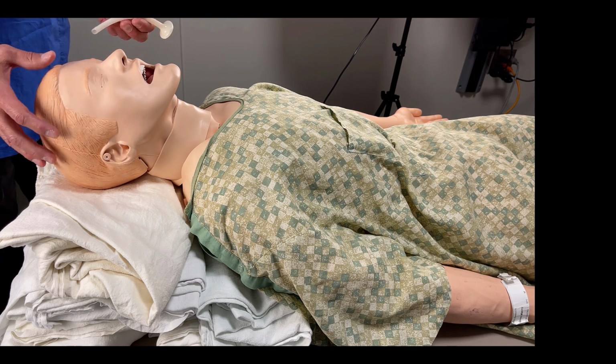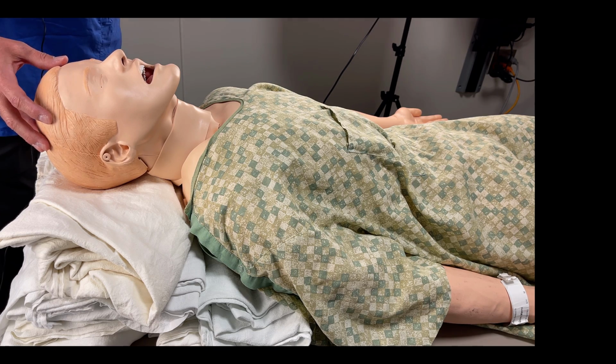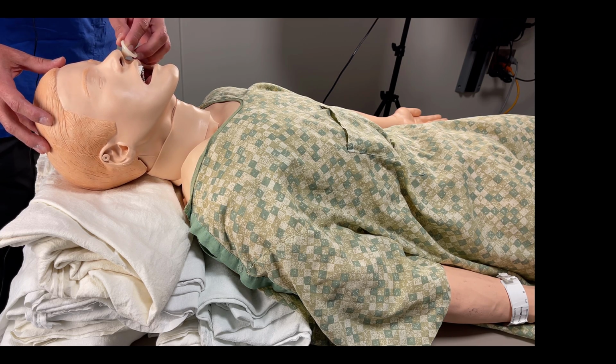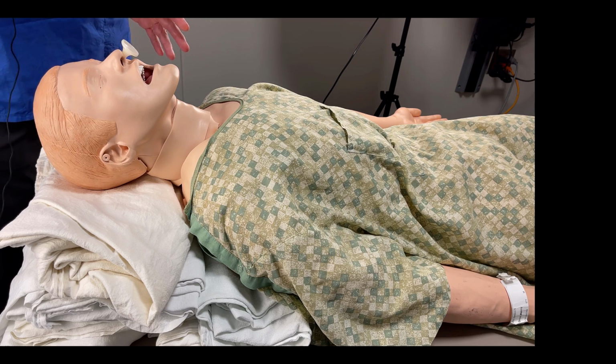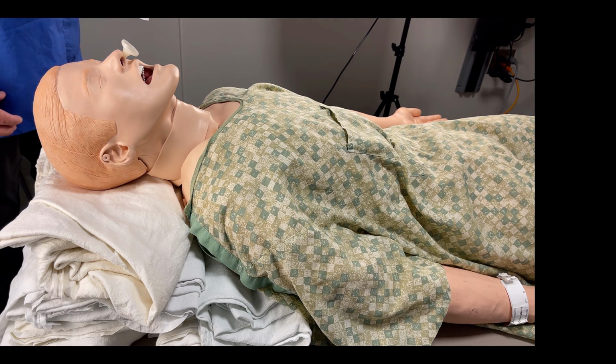I've got my patient in the proper position. I've inspected the airway, and there are no contraindications to placing it. So I'm going to gently slide this in. Now this is a mannequin, so sometimes this doesn't work as well, but it should slide in gently. The patient tolerates it. Now I have my NPA in place. I can look at my unconscious patient to place an OPA.